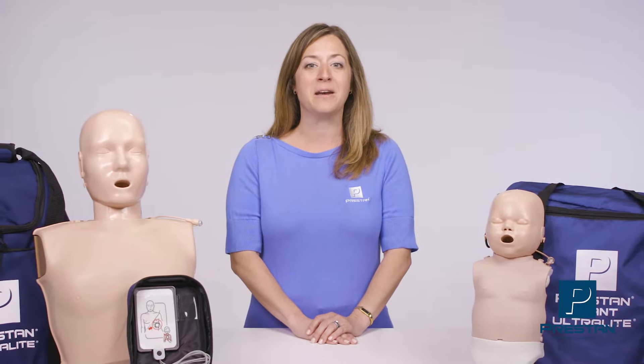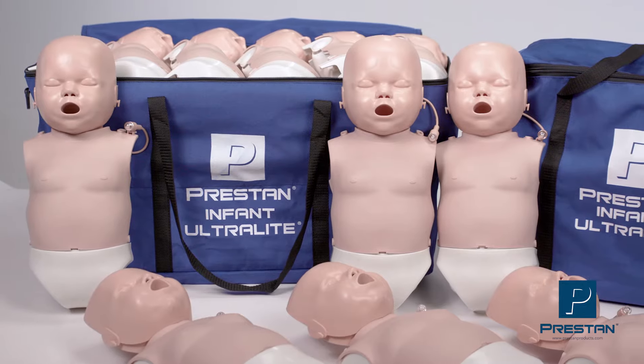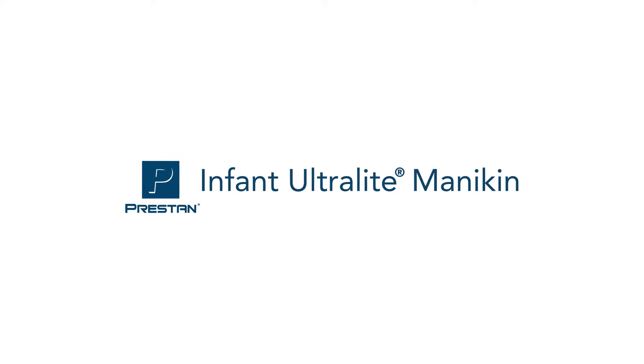For instructors who value lightweight, portable products with easy setup, the Ultralite series is a perfect solution. Introducing an exciting addition to the Ultralite series of products — the Prestan Infant Ultralite Manikin is now available.